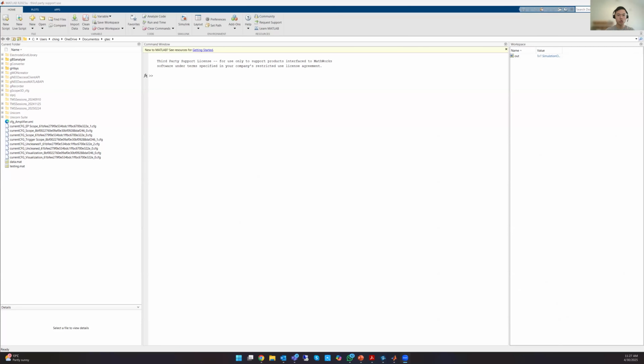Okay, maybe I show you the device a bit. So this is a Nautilus device, Nautilus Pro Flexible. As you can see, there's a strand coming out here. You can easily detach it and attach a different type of strand. This strand is a bit special. It has a multi-purpose connector here.